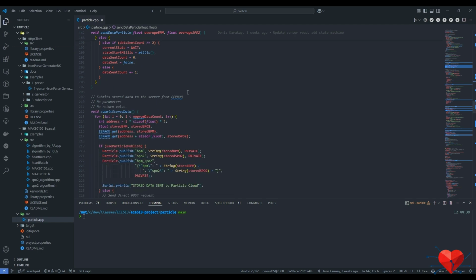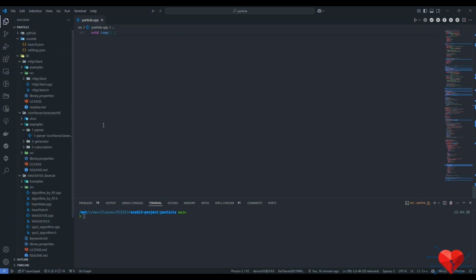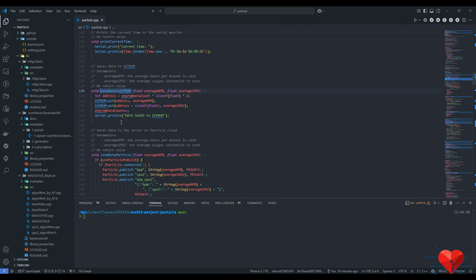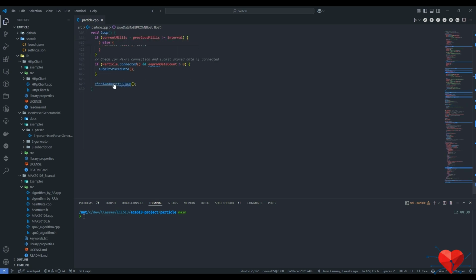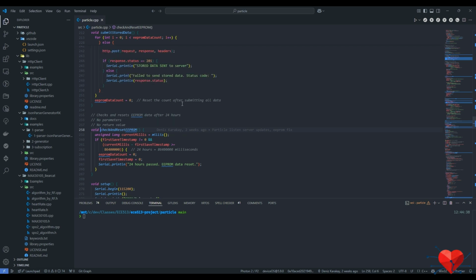So there is also the EEPROM side, which, let's say we don't have the internet connection. What we are doing actually, we are going to the EEPROM state, and we are saving those data to EEPROM. And we can save multiple. You don't have to save just the last one. And we are checking for 24 hours before. So those data can be stored only for 24 hours, and it will be reset after 24 hours.